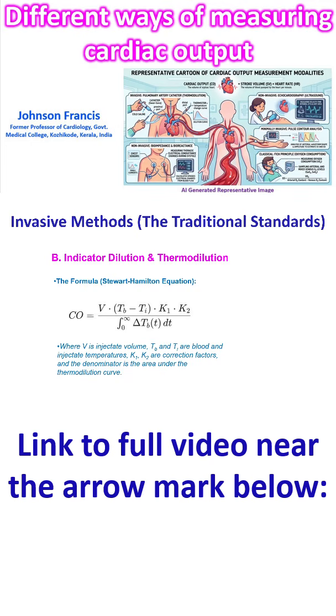the Stewart-Hamilton equation. It's a very complex formula where V is the injected volume, Tb and Ti are blood and injectate temperatures, K1 and K2 are correction factors, and the denominator is the area under the thermodilution curve. While it is highly accurate, it is prone to errors in the presence of severe tricuspid regurgitation, intracardiac shunts, or rapid fluid infusions during measurement.